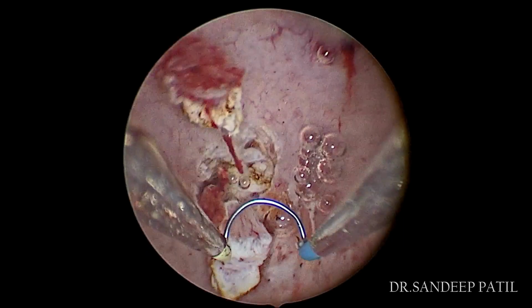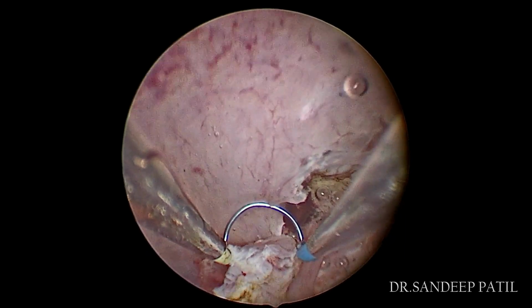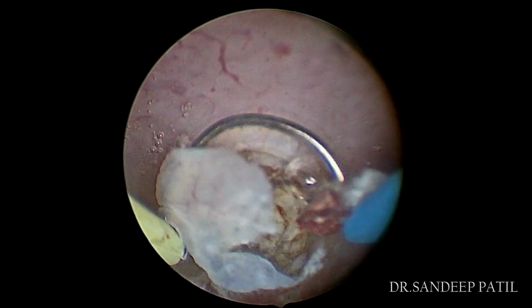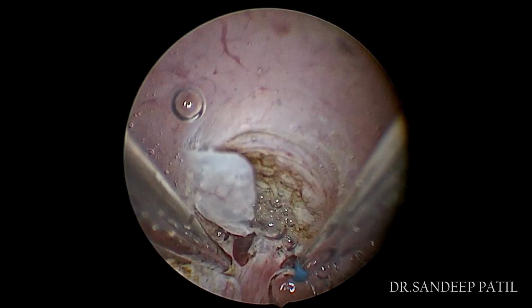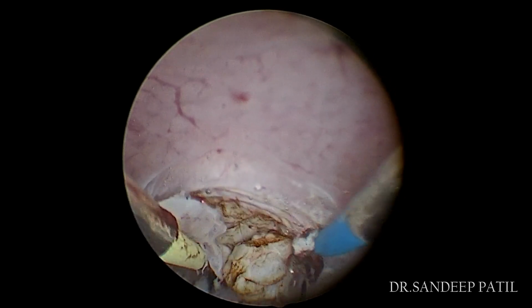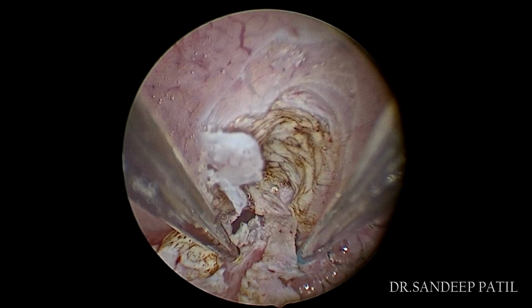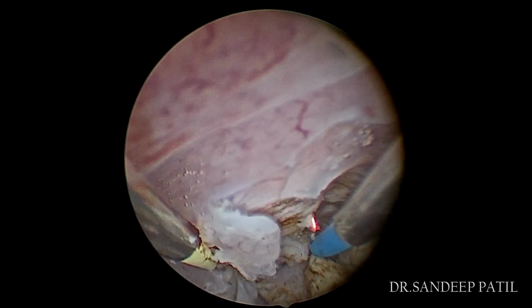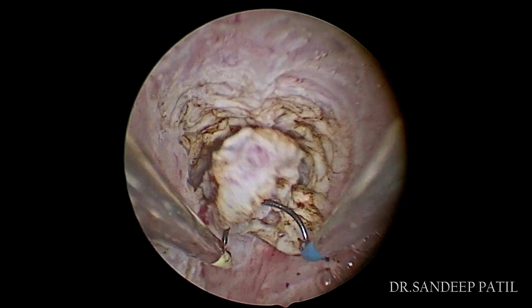The FIGO 3 fibroid is completely intramural. At the same time, it is abutting the endometrium without protruding into the cavity. This fibroid is not submucosal but very close to the endometrium. Imaging modalities can confuse between submucosal and intramural fibroids.